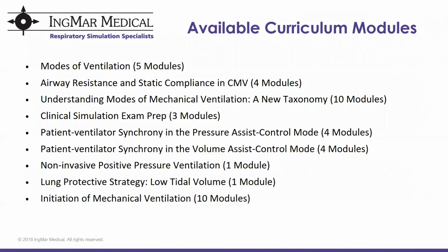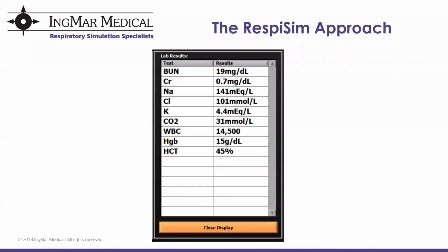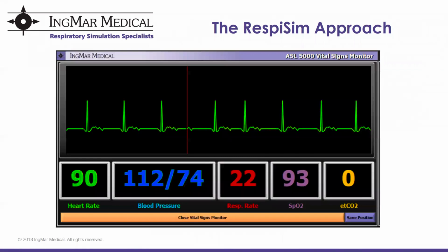So that was the screen that you saw a few times during the scenario. I can even back up a little bit here, show you what it looks like. And basically for our pre-created scenarios, we have selected the values that would be displayed there for the student at particular points in the scenario. But you as the user always have the ability to enter your own values or change the ones that we've selected so that the right values appear at the right time on this simulated vital signs monitor.